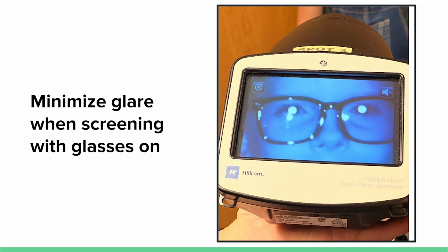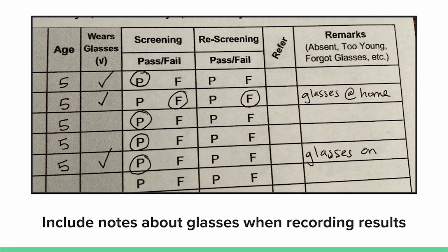If a subject is wearing glasses, you can use the Spot screener to determine whether or not their prescription is up to date. The lenses of their glasses will frequently reflect light sources in the room, which may make it difficult for the Spot to complete the screening. Making slight adjustments to the position of the subject can minimize the glare coming from their lenses and allow the screening to be successfully completed.